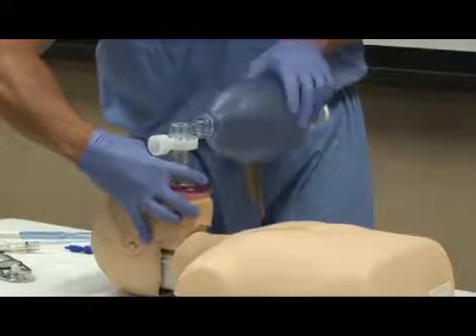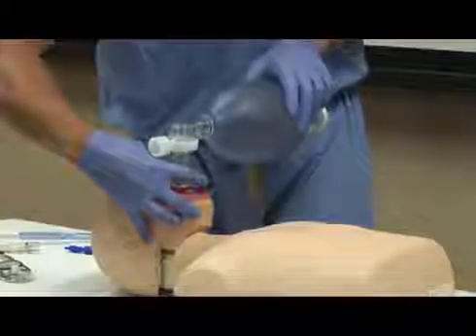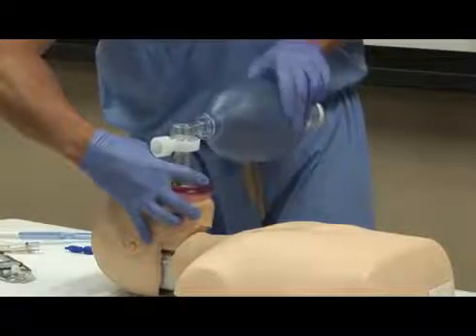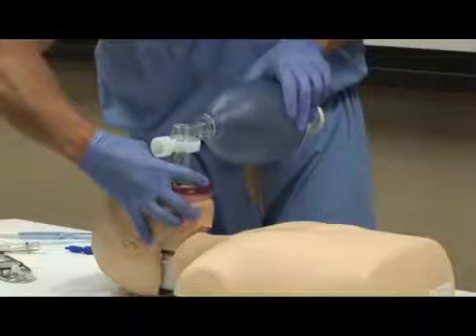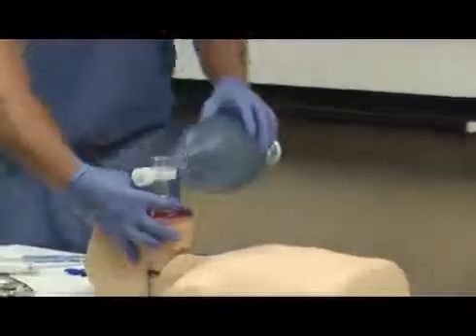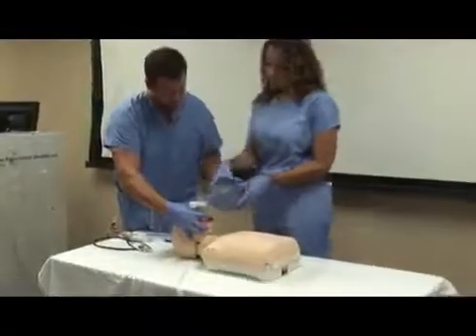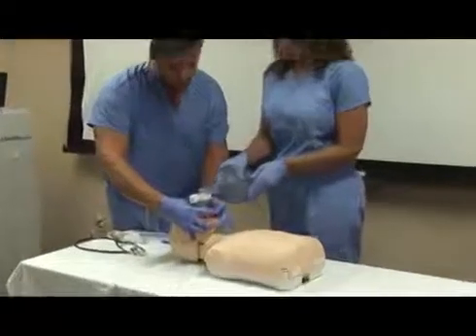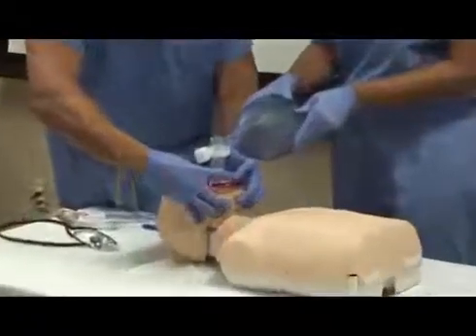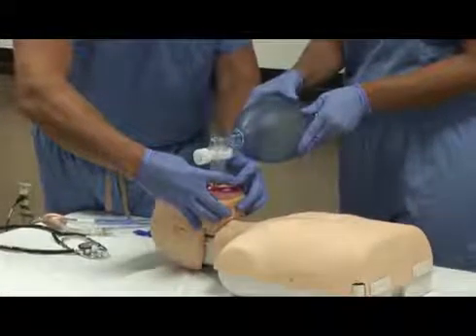Now maintaining this position, the provider squeezes the bag, taking one second to provide one ventilation. If a second provider is available to assist in bag mask ventilation, one provider will deliver ventilations with the bag, while the other provider provides the EC formation with both hands to the mask.